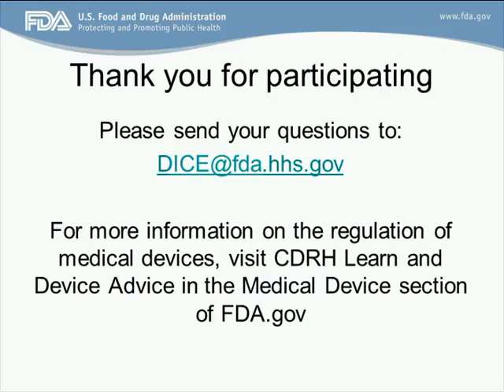Okay, thank you. Next question is from Kurt Farrell. Your line is open. Yes, hello, and thank you for setting up the webinar. This has been helpful. Medical devices used internationally for home and hospital environments, typically in our field, start off in the hospital, and then they're discharged appropriately out of the hospital environment. So specifically, the IEC 60601-1-11 poses an interesting strategy from a design perspective because hospitals prefer grounded power devices, whereas the Dash 11 standard is not. Do you have any comments or thoughts on that? You broke up. If you could just ask your question one more time, please. Do you have any thoughts on grounded versus ungrounded in the hospital, and then when patients are discharged with medical devices, where the home-11 standard requires ungrounded?